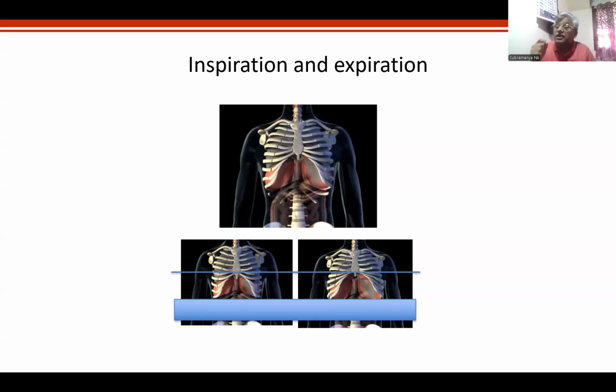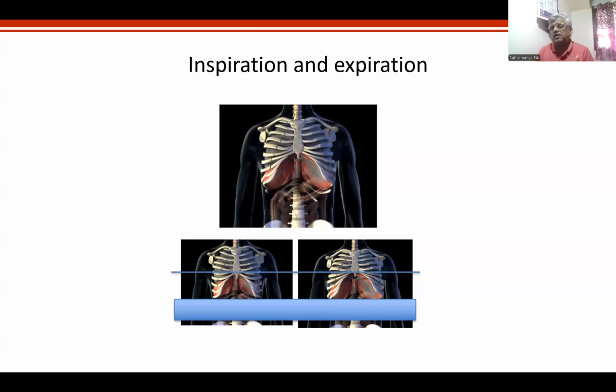It is beneath. And that's why whenever you take the X-ray, you don't find, sir, what is this? X-ray is not helping. How will the X-ray help you? Because you don't know what is X-ray. That's the problem. And I will tell you, the lower half of the chest is best seen on lateral X-ray.